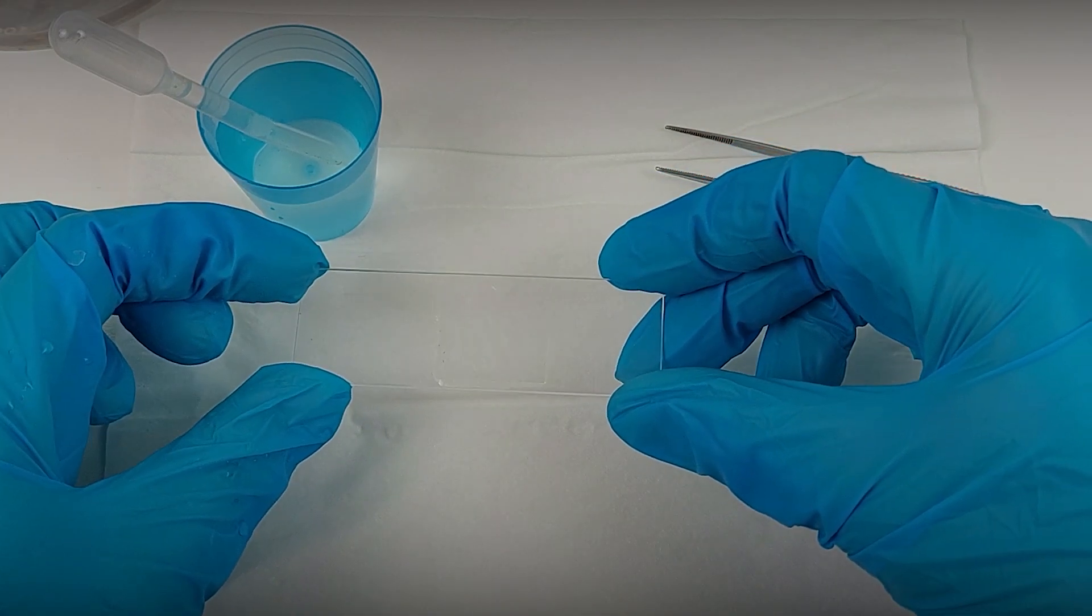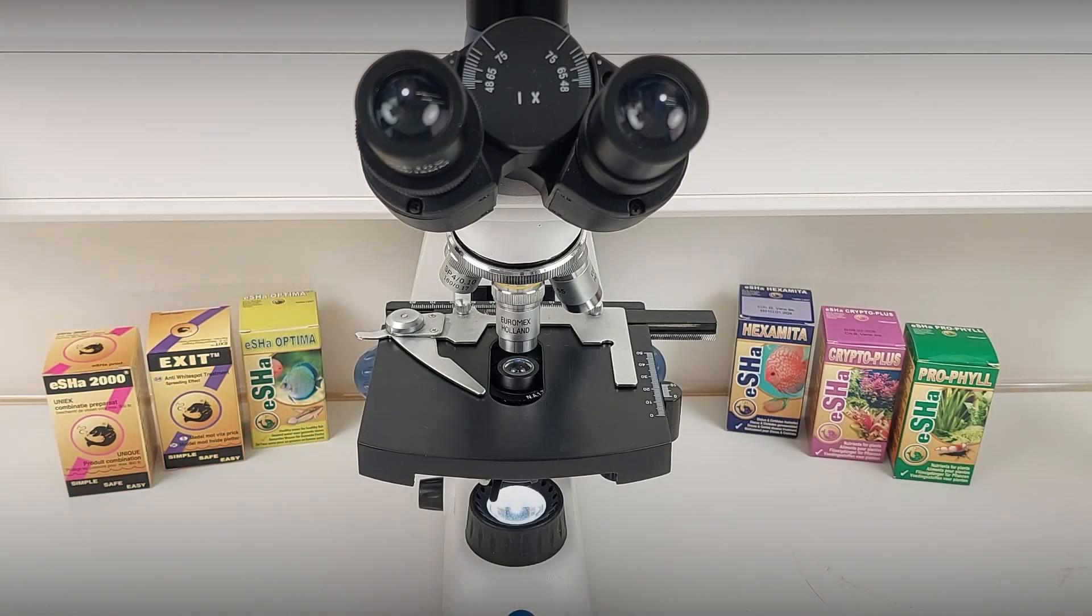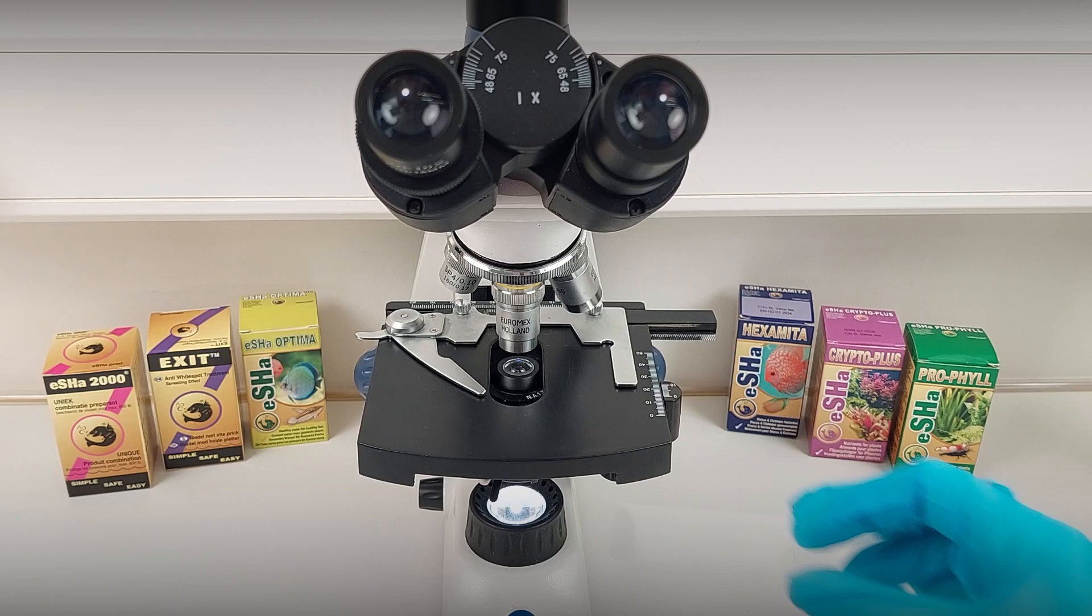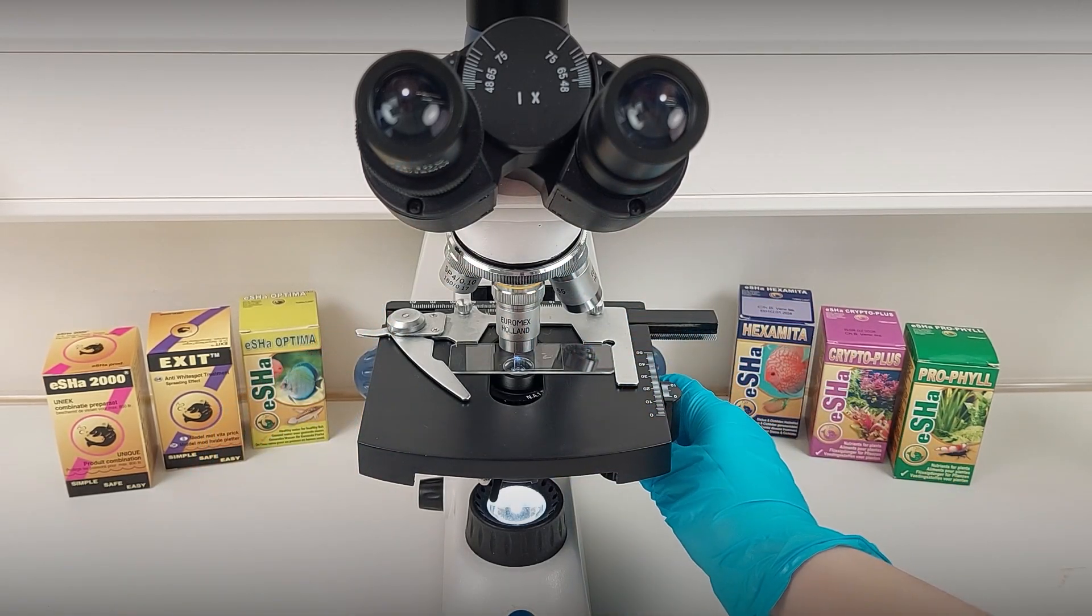The specimen is now ready for microscopic examination. It is important to examine the specimen within 5 minutes after the scraping, because we will be looking for moving parasites under the microscope.